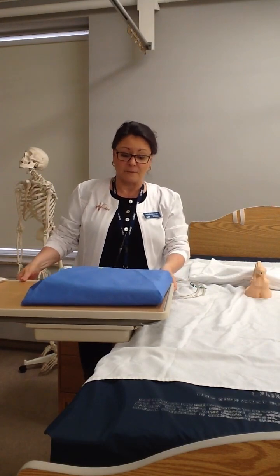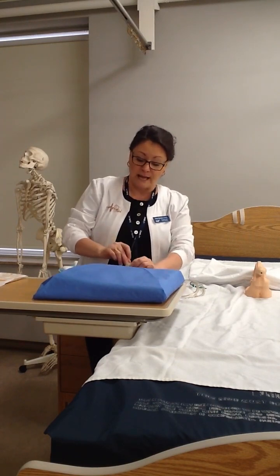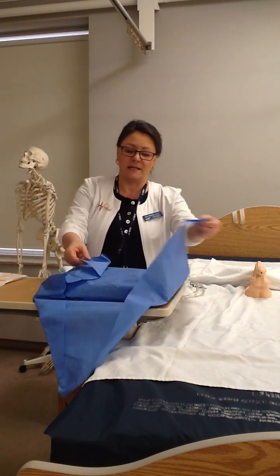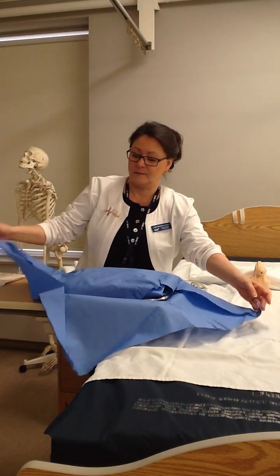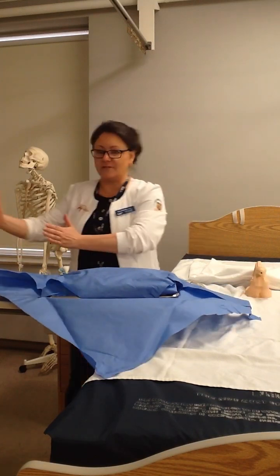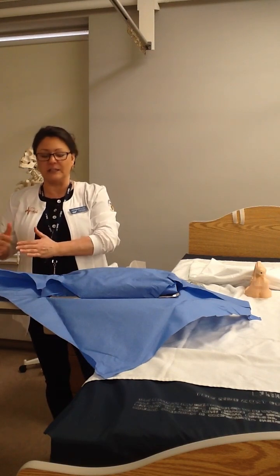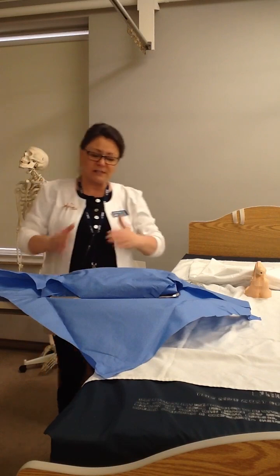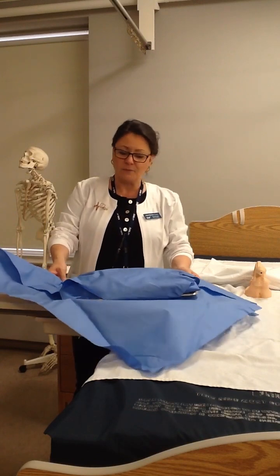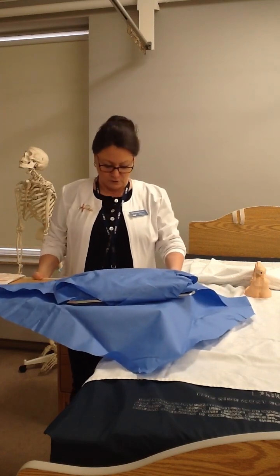When I'm sure that it's safe, then I'm going to go ahead and start opening up my drapes. And so I'm going to pull the tape down, and again, this procedure never changes. The first drape is away, and then side, and side. And right away, I'm looking to see the end of this bedside table, because when I'm done, I want to be able to apply my gloves and that packaging not overlap onto the blue packaging. So as soon as I start looking at my tray, be aware of what's happening at this end too, and start to manipulate your tray accordingly so that you're opening up lots of nice space there. You can see I'm moving things around. You can move your table around.